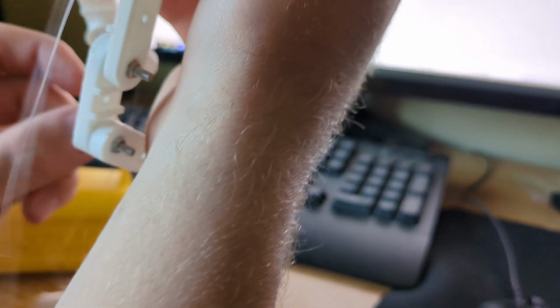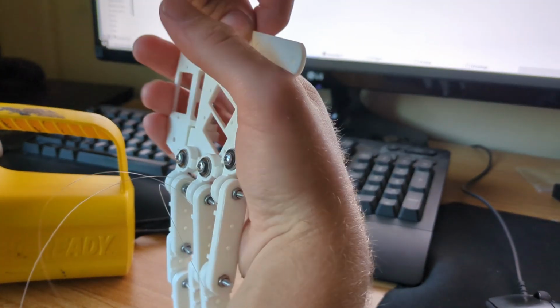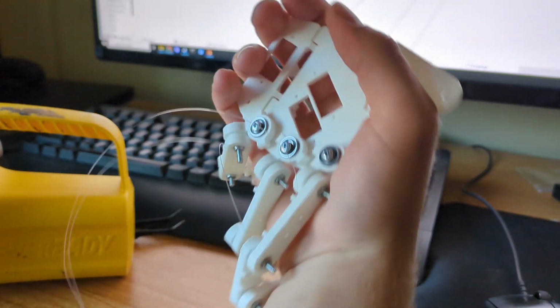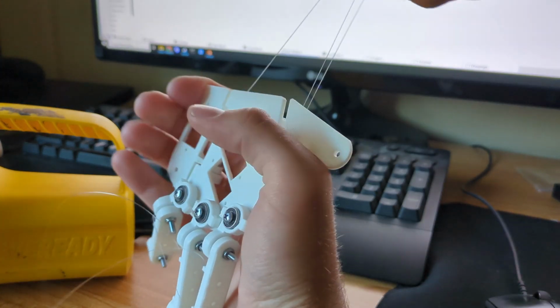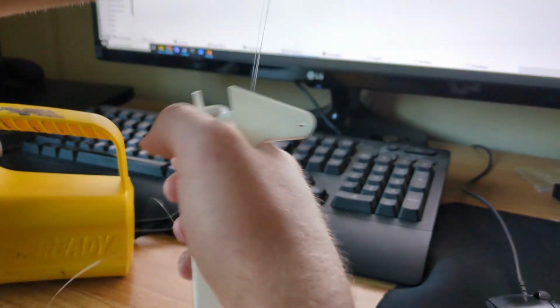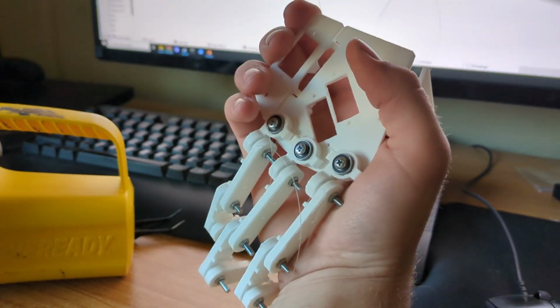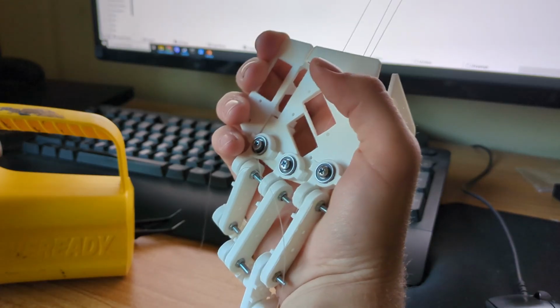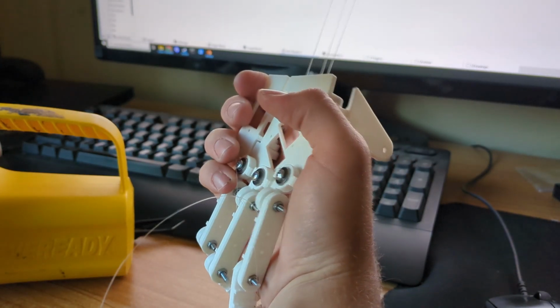Let's see if I can shake my own hand here. This is something I've been doing too, just to test, to see if the anatomy feels shaped correctly. And check that out. Boom. It's not terrible. The hand feels a bit wide, but I think that's okay. Thumb can grab across. Yeah, it works. The fingers grab pretty decent there.